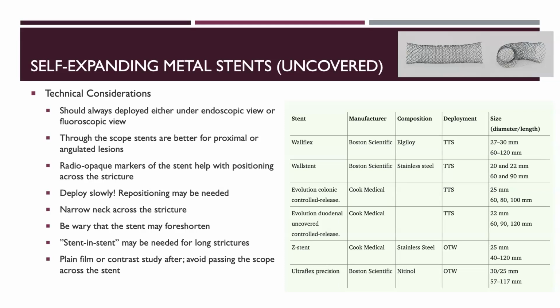So typically there's a marker both on the device side and on the fluoroscopic imaging side on the stent itself that tells you, hey, I am at the point of no return. I am not able to reposition. Again, anything before that point, you can start all over again, right? But once you're beyond the point of no return, it's going to be very hard to reposition that stent.